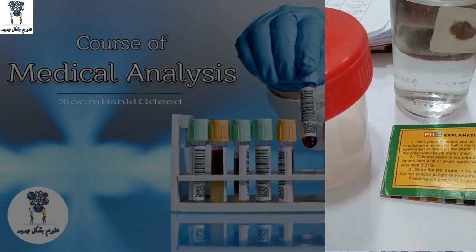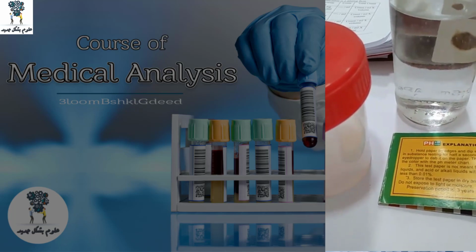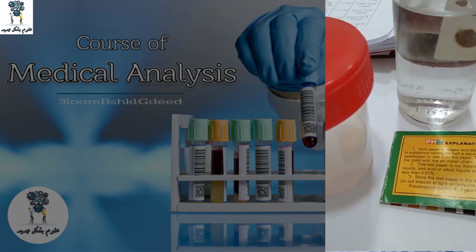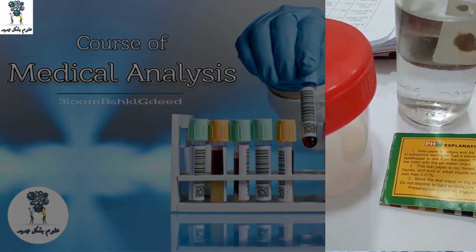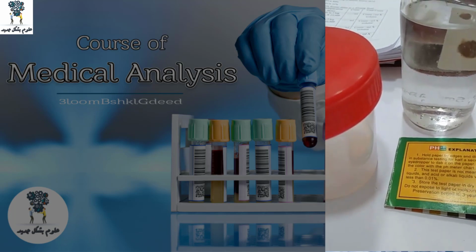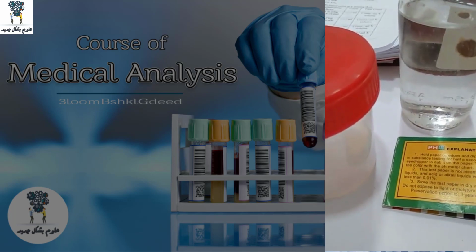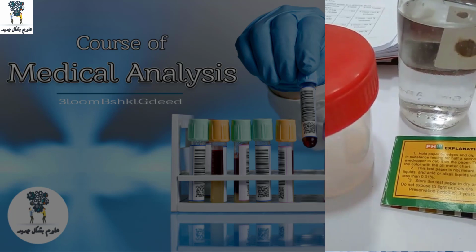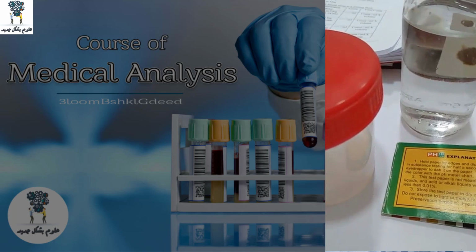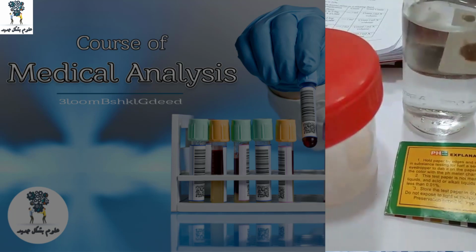So in this case, when we find agglutination, sperms gathering together and unable to move, it is not a normal case. At this point, we will make a note for the doctor in our comments. We will write: anti-spermatozoa antibody test is recommended. What is the anti-spermatozoa antibody test? It is a test to identify if there really is a problem or not. It is like a confirmation of our case.